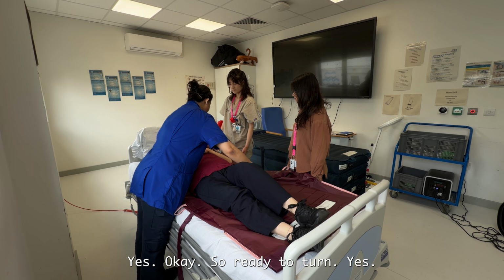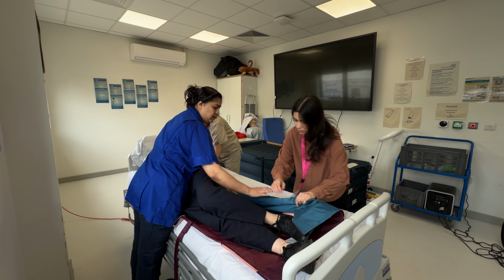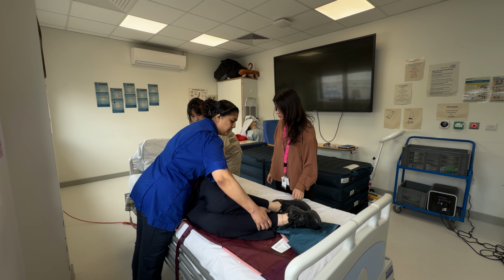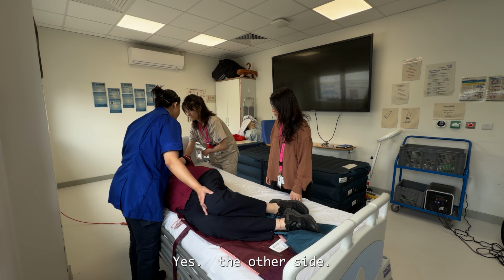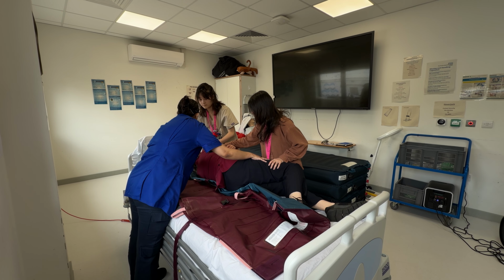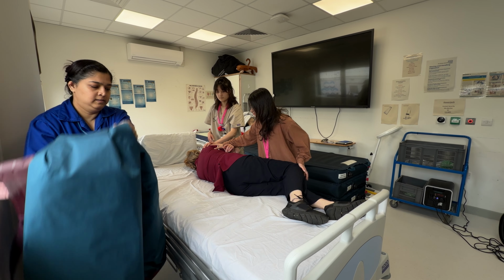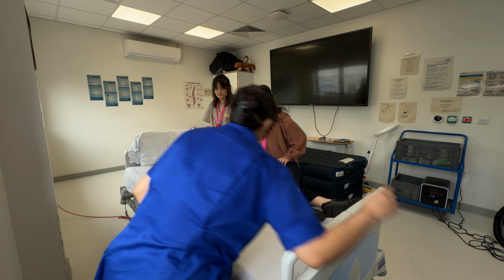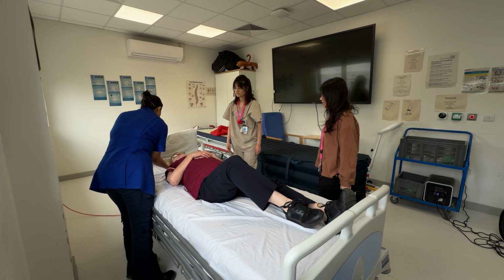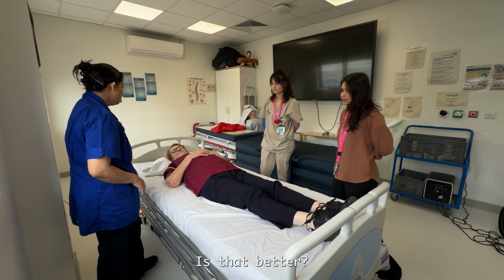So ready to turn? Yes. Turn towards me, start folding like we fold the sheet. So put the legs of the sheet. Are you ready for your second turn? Yes. Okay. On the other side. On your back. Then you can lift your head up for me. Is that better? Yes, thank you.